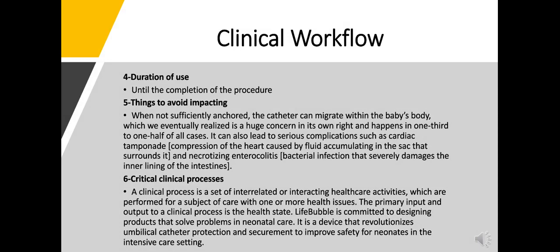Things to avoid: the catheter can migrate sometimes within the baby's body, which is a huge concern, and it happens in one third to one half of the cases. It can lead to serious complications such as cardiac tamponade and necrotizing enterocolitis.